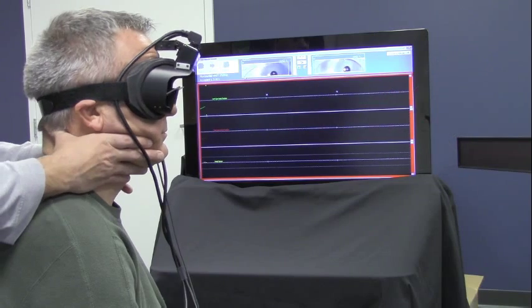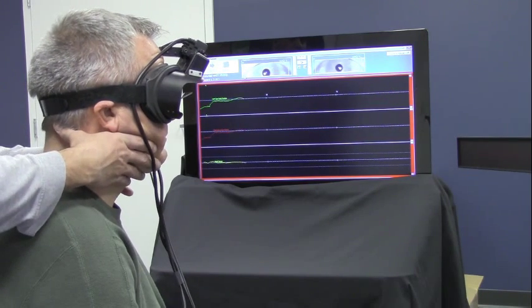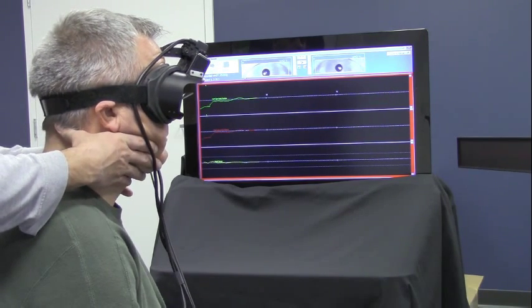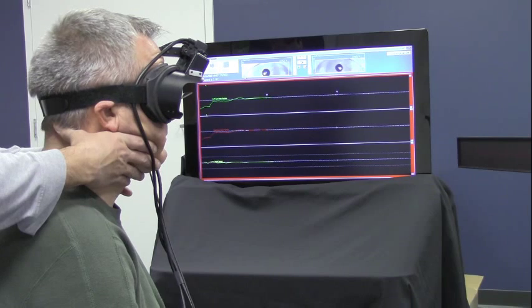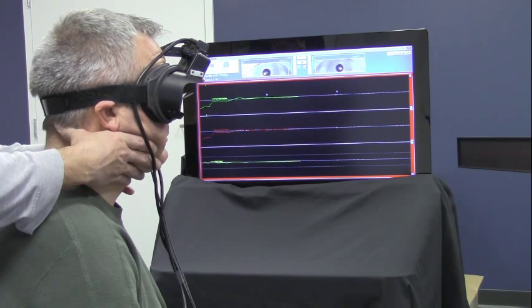With the audible clues, you can focus on doing your head thrusts without worrying about the computer or screen.